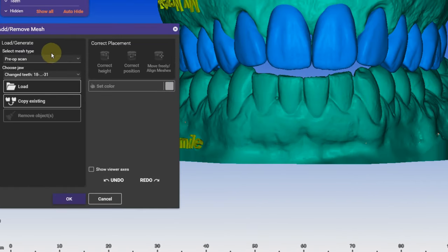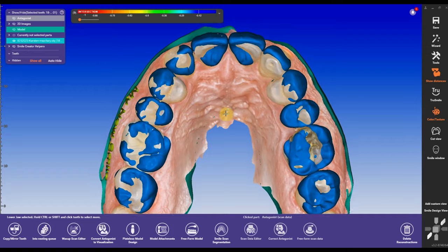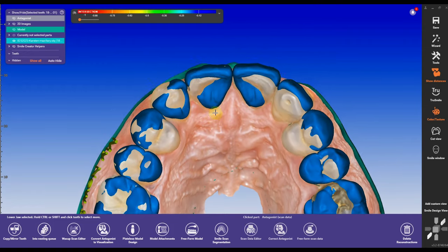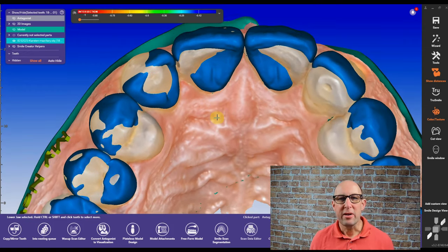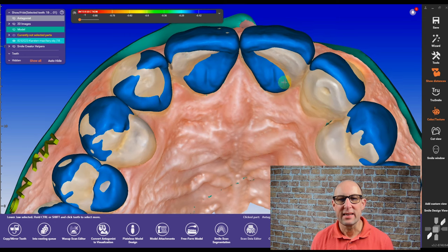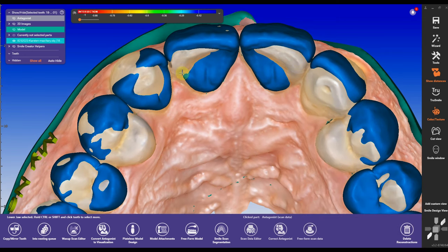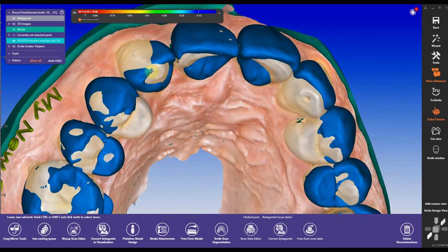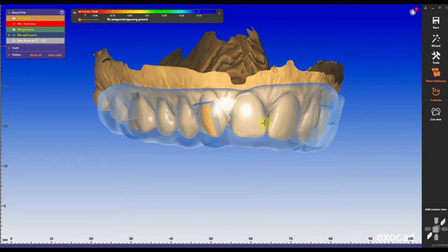Then I'm going to add and bring in a pre-op scan, which is actually the scan before I did the modification. Here you can see that my central is intersecting into the design, as well as a canine intersecting in the new position of the laterals.